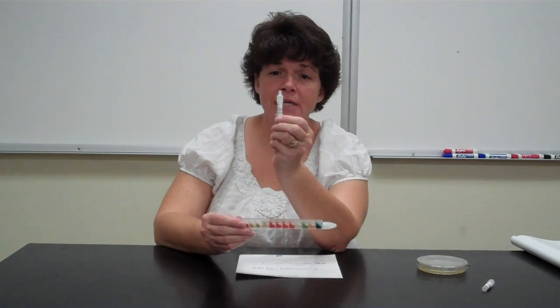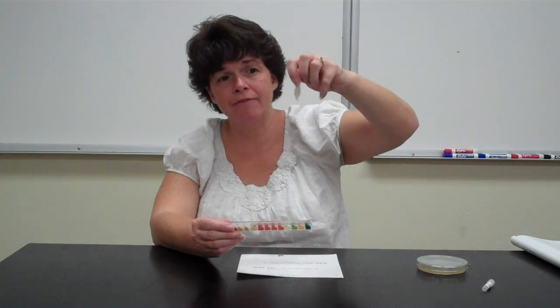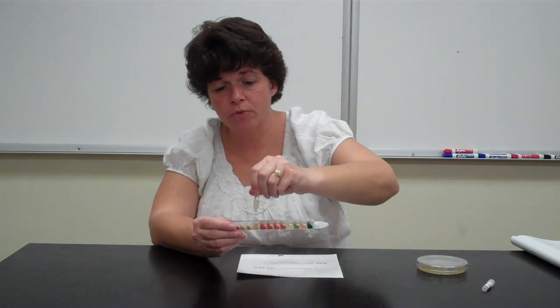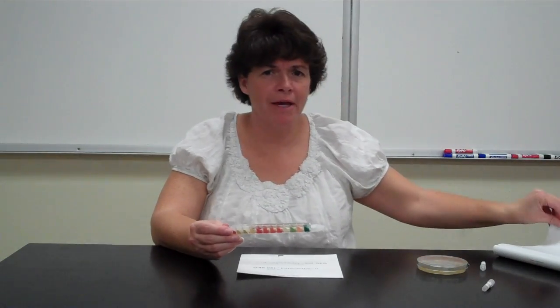And then you'll take the reagent, which is usually called Kovacs reagent, but ours actually says indole. This is one of those little ampules that you have to break, and then you squeeze it and you just drop a drop in there. Okay, and you should see a result pretty quickly with that one. I'm trying to remember. Look in your manual to see if it says to wait a certain amount of time.